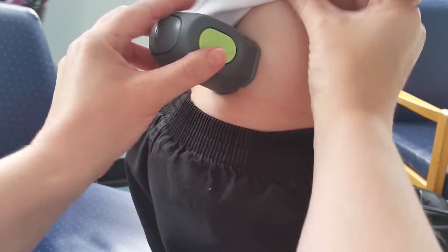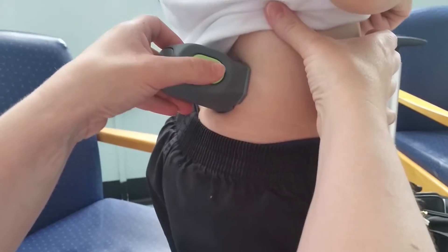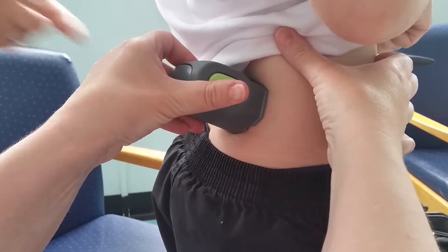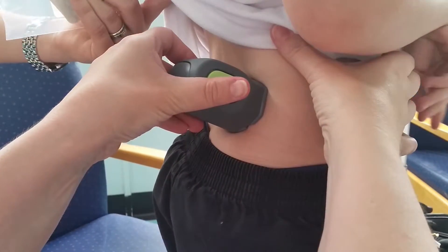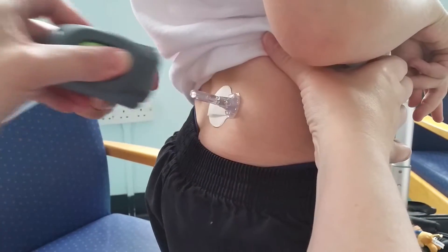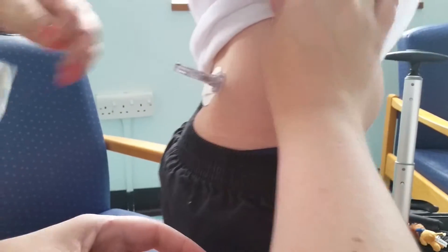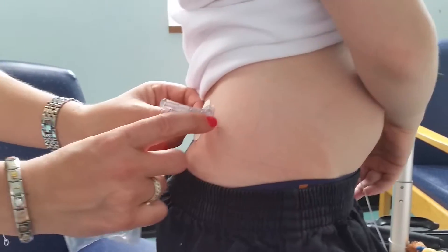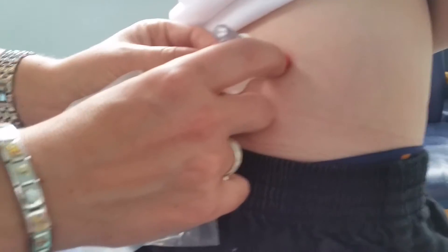Gently on the skin. Do you need to clean the skin first? No. Press the tic-tac-y button, let go — one Mississippi, two Mississippi, three Mississippi, four Mississippi, five Mississippi — press the button in and take it off straight. Wow, look at that.